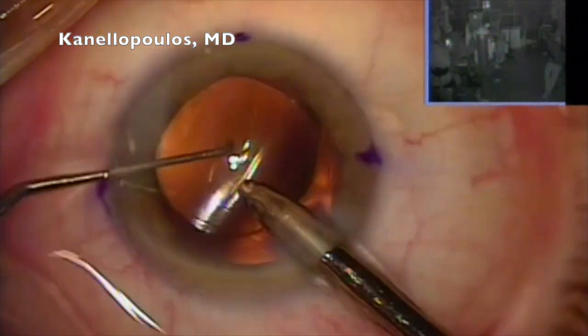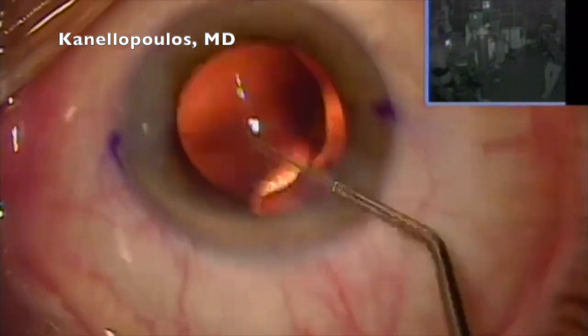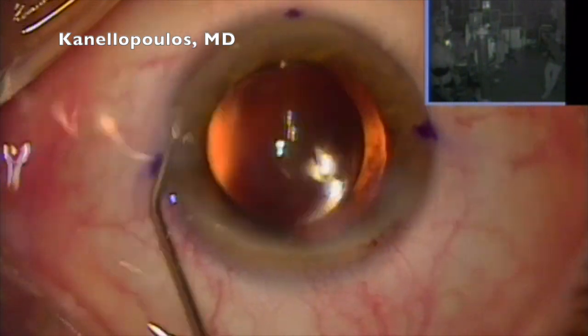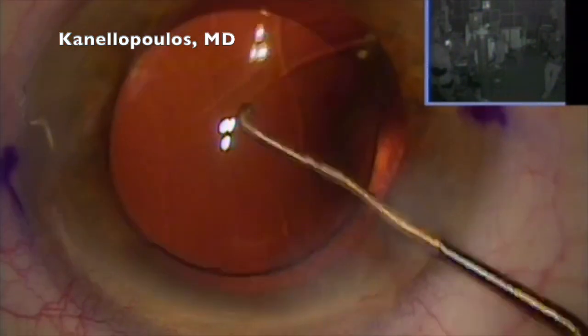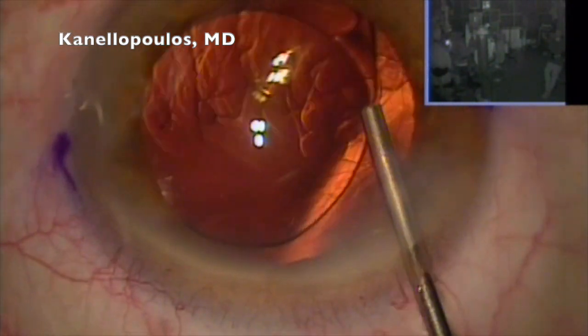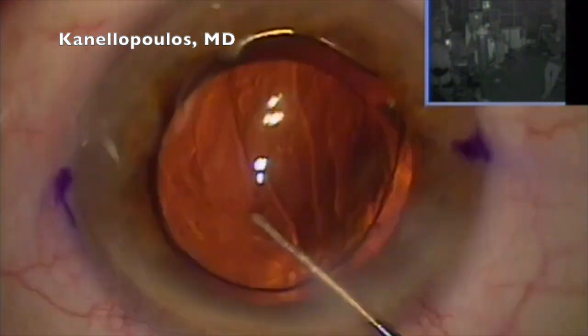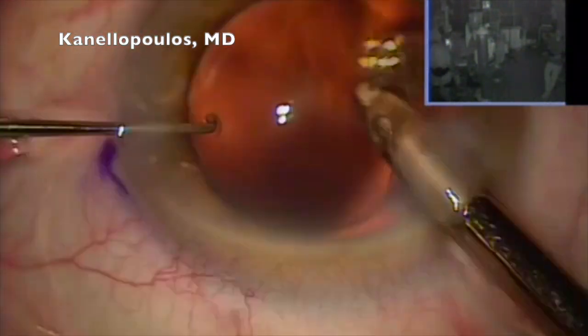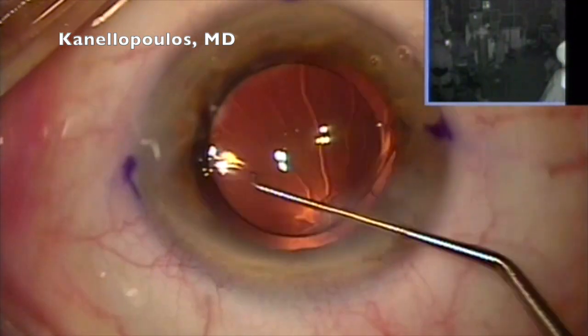Very important step here. Sometimes this may pop the lens into the sulcus. You have to be very careful and recognize that and replace the lens in the capsule bag. Otherwise, you'll have a zigzag lens and poor centration, maybe astigmatism. I think this is one of those cases. Yeah, the lens had popped in the sulcus. I'm realizing it, and I'm putting this haptic back in the capsule bag. Everything in place. Looks like 2 seconds delay, but case great.